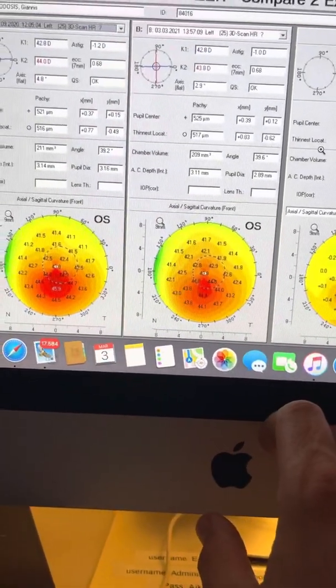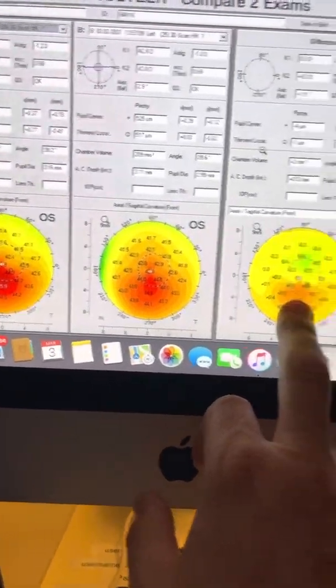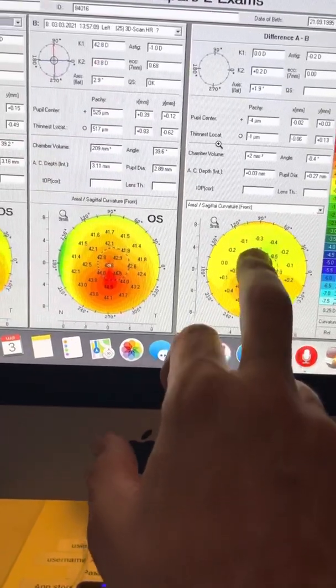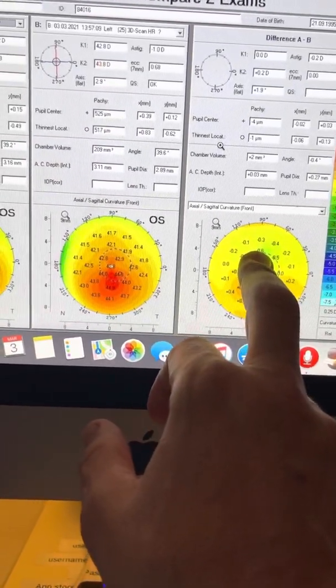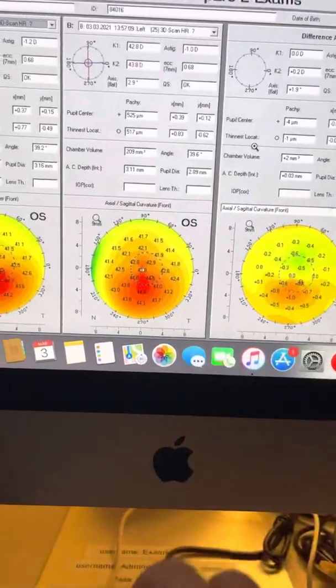One diopter flattening at the peak of the cone, as we can see here, and steepening of about 0.6 diopters at the superior cornea.